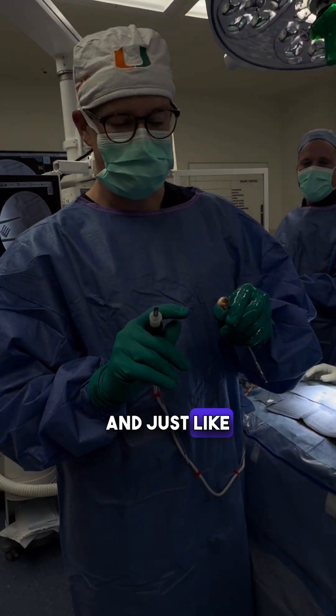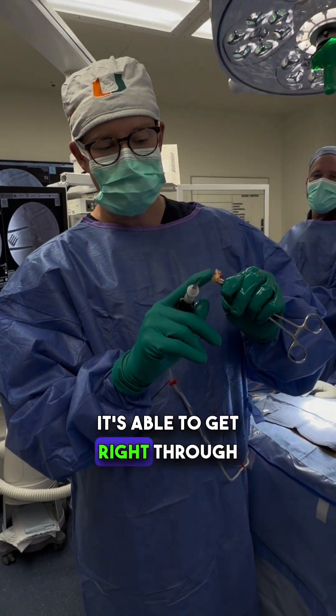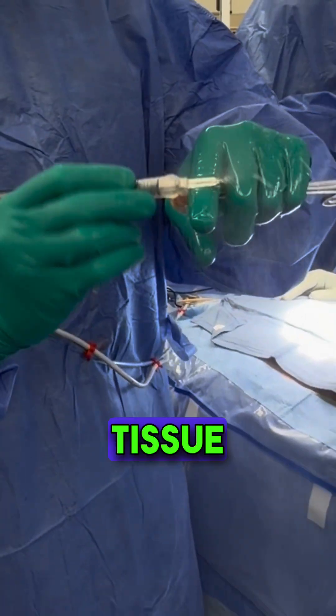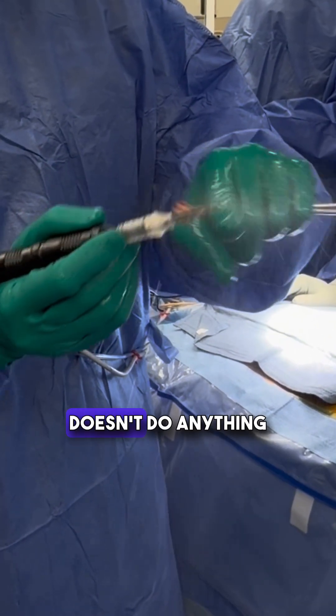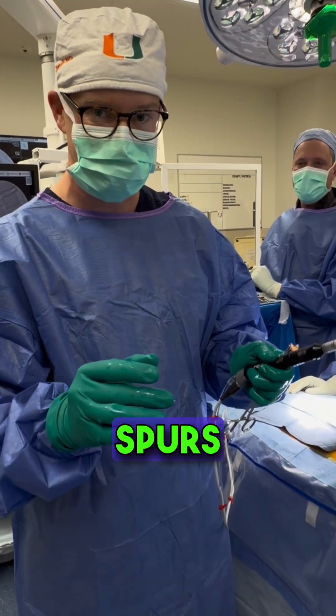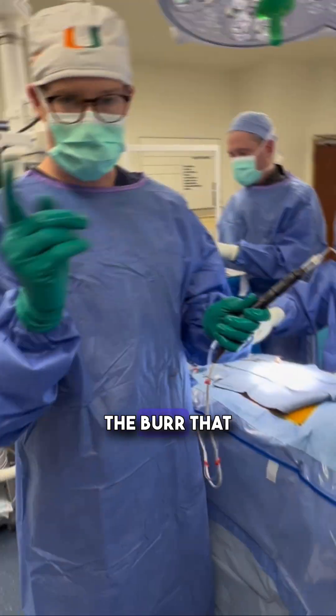Just like that, it's able to get right through the bone with a nice clean cut. For nerves and soft tissue, it just pushes them away — it doesn't do anything to your skin, doesn't do anything to the glove. But for bone, this hard surface — just like bone spurs — it cuts right through.